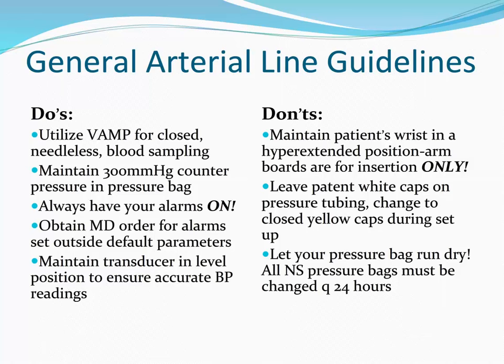Be sure to get an MD order if you need to change your default alarm parameters. This goes for the above scenario, but in other cases like managing acute hypertensive crisis, the clinical parameters on these patients don't generally fall within the same range as our system defaults. Remember to maintain the transducer in a level position to ensure accurate displays of information and data capture in CS link. This is a bit of a maintenance project, as other providers, patients, and families can change the bed position.